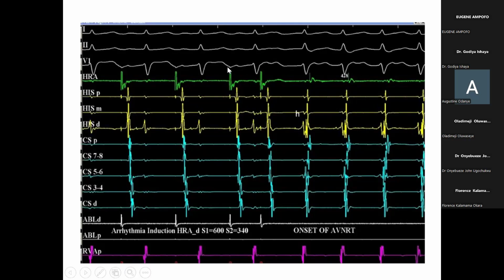You get what I mean? Yes, sir. Exactly there. But now it's just close to the QRS, which we will now call the RP interval. So if you measure the interval here, it should be less than 70 milliseconds, okay? That's part of what you use to make a diagnosis on your EP when the tachycardia starts: it tells you that it's a short RP interval. You get that, sir?